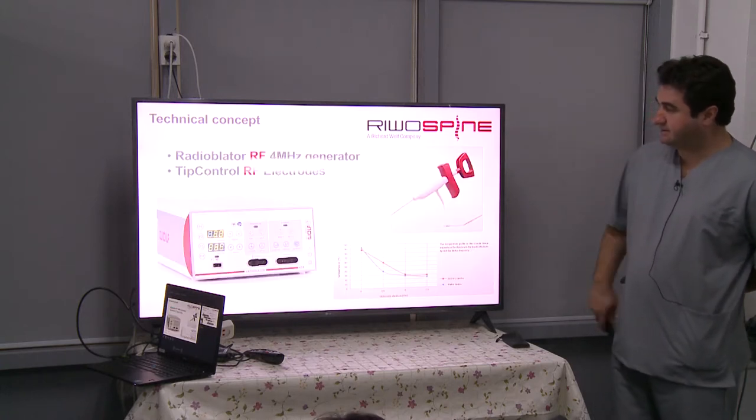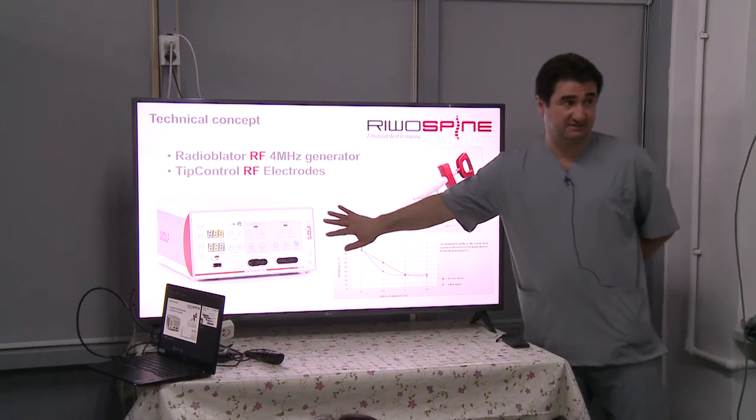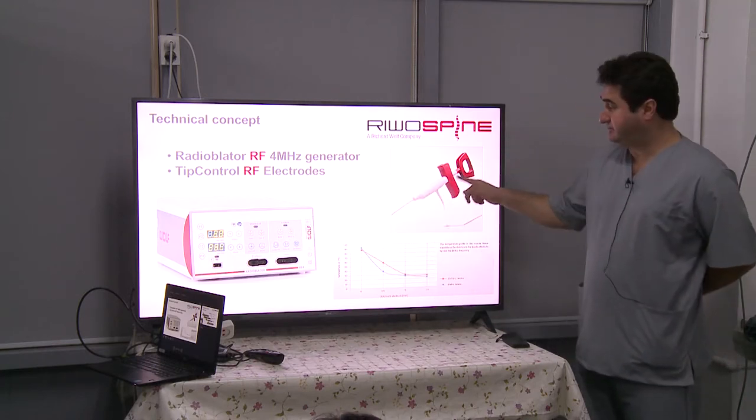Okay. Another important device for us is the radio frequency device with the tip control.